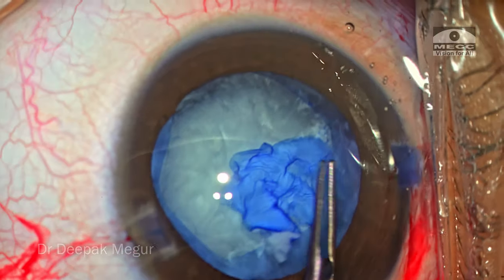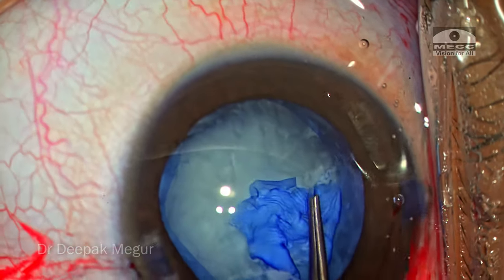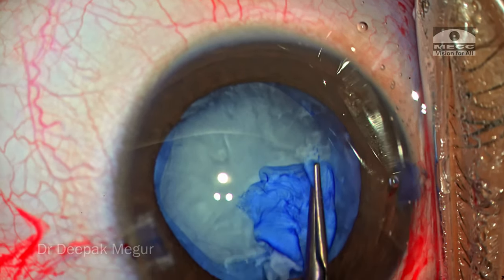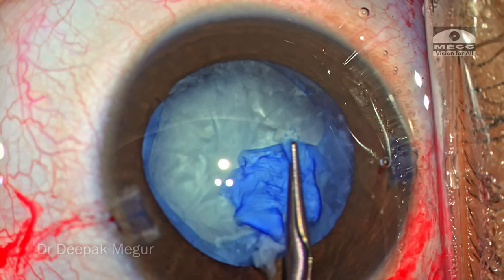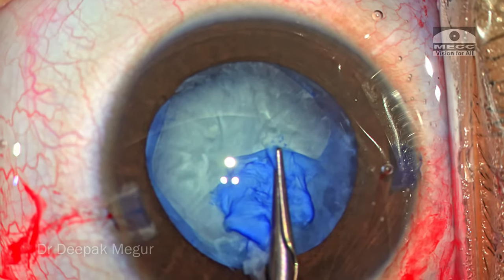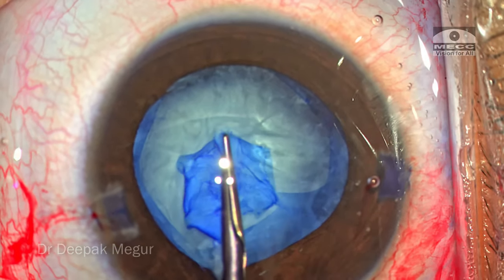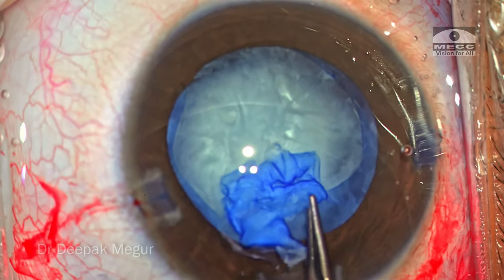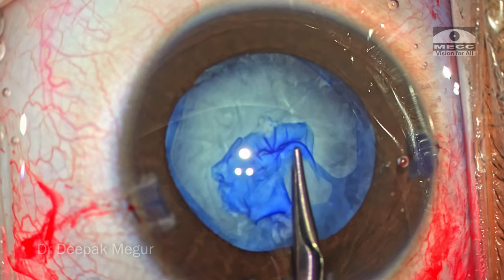The direction of pull is always centripetal and the capsule is kept flat. Carefully but surely, the entire fibrotic zone is negotiated and the capsule tear is beyond the area of fibrosis — eventually I could complete the rhexis. Although the rhexis is slightly eccentric, I would take this on any day.